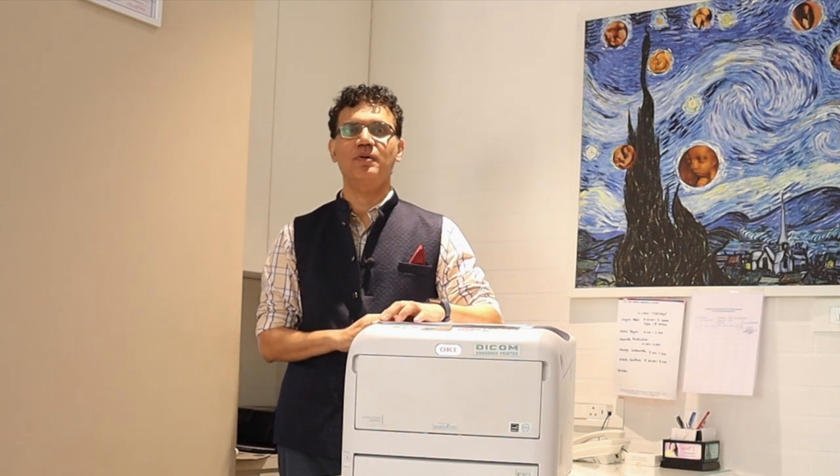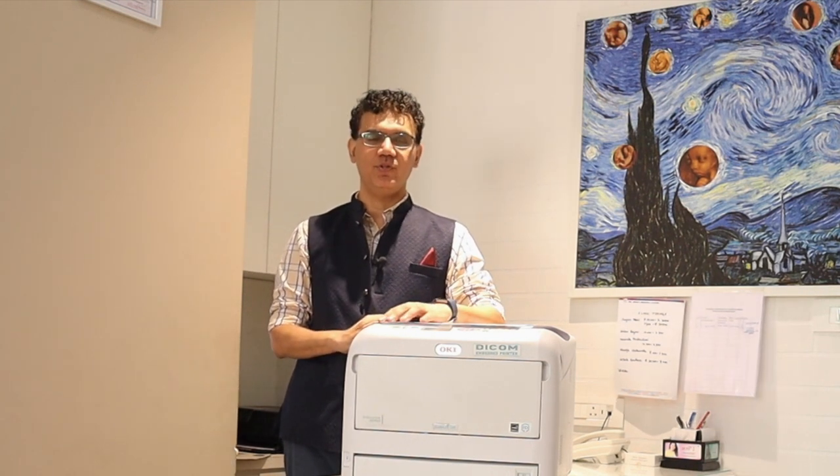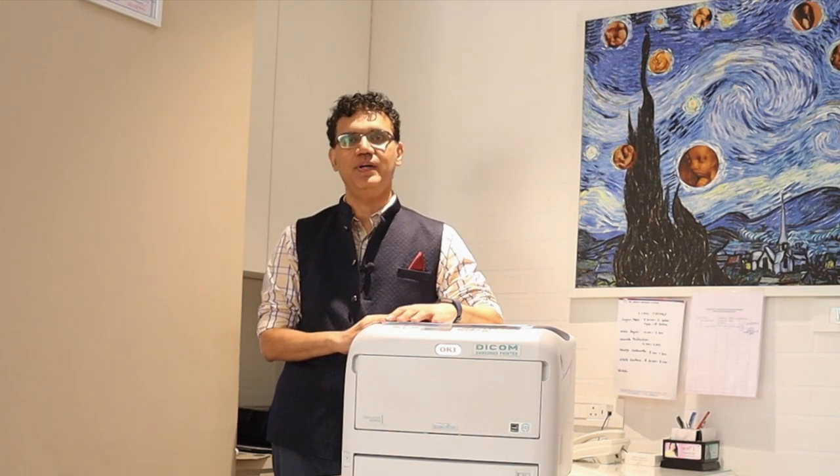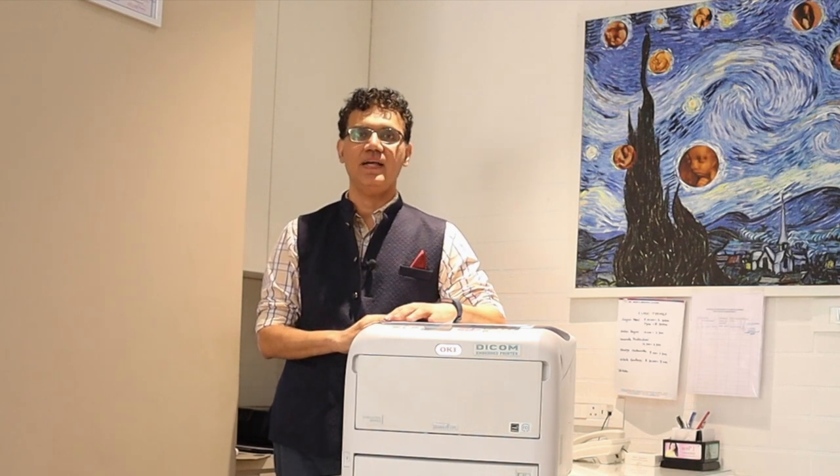Hi friends, this is Dr. Sanjee Mani from indianradiologist.com and once again we are going to do a product review today of a wonderful new printer from SS Digitech. This is the Okie system and it is a DICOM printer.